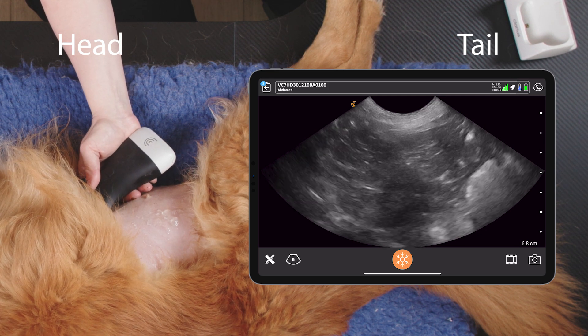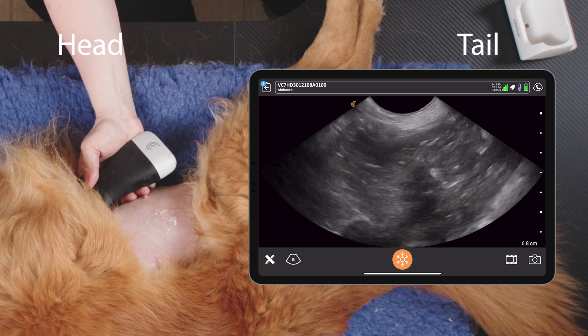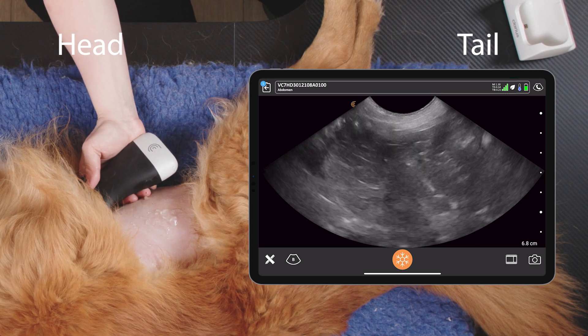Now in a bit more of a longitudinal view, fanning all the way through. That's how to scan the gallbladder in a dog. Thank you.